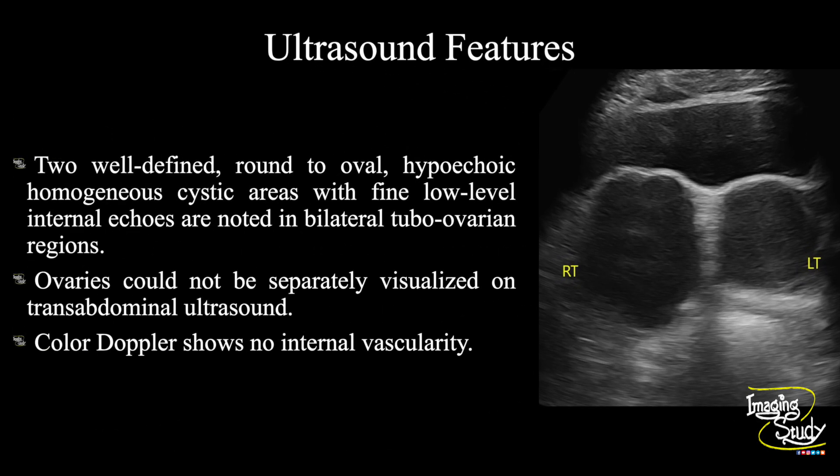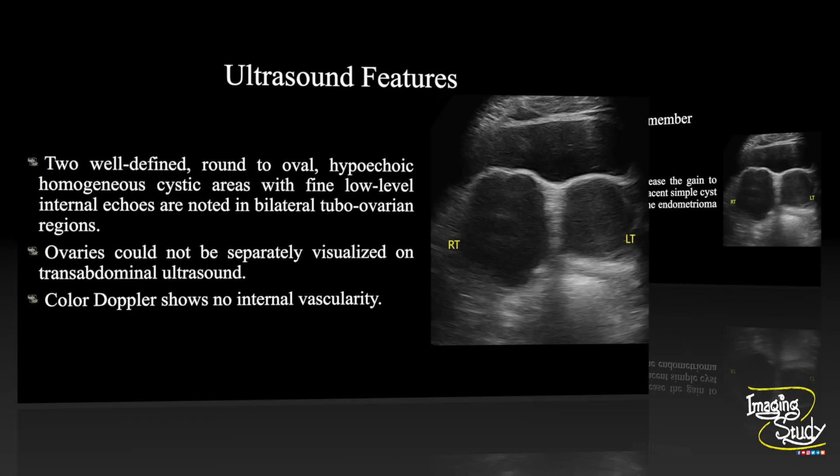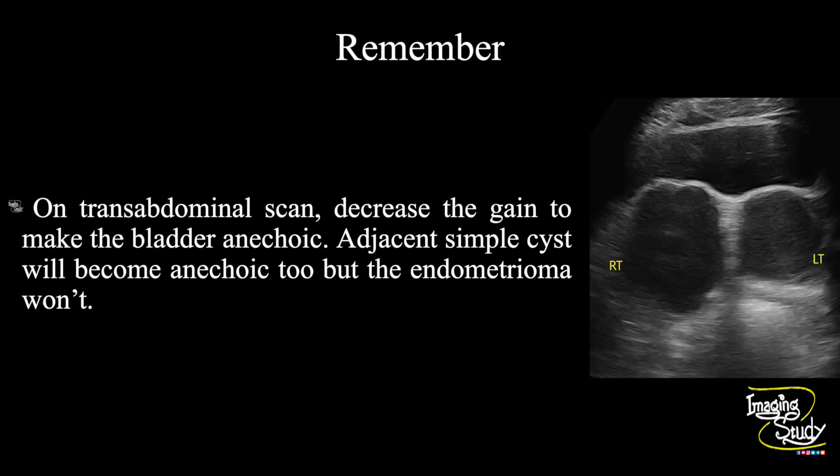In summary, two well-defined round-to-oval hypoechoic homogenous cystic areas with fine low-level internal echoes are noted in bilateral tubo-ovarian regions. Ovaries could not be separately visualized on transabdominal ultrasound. Color Doppler shows no internal vascularity. These features are concluded as a case of bilateral adnexal endometriomas or chocolate cysts.